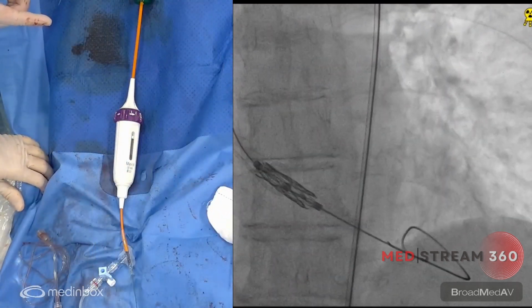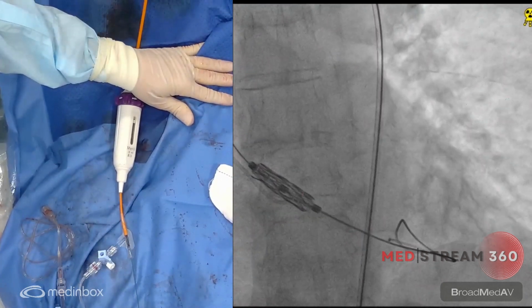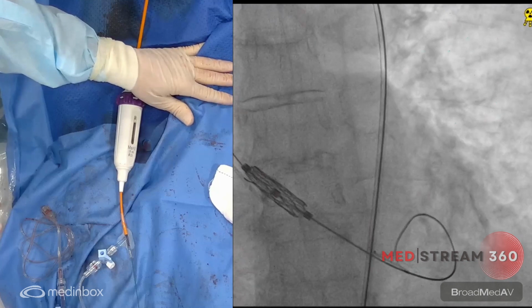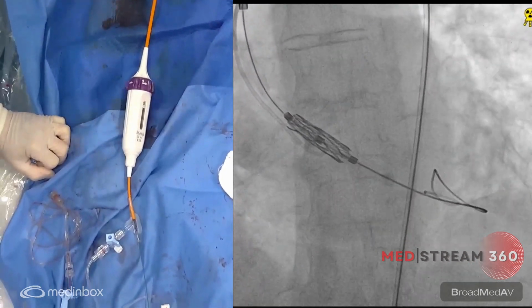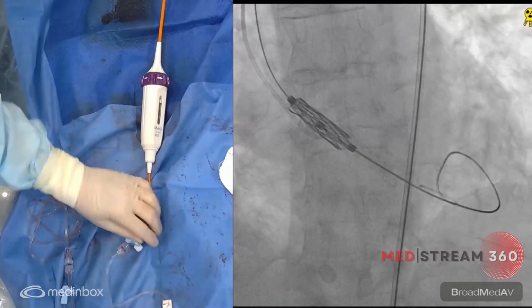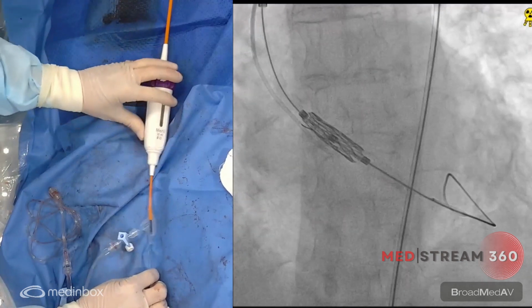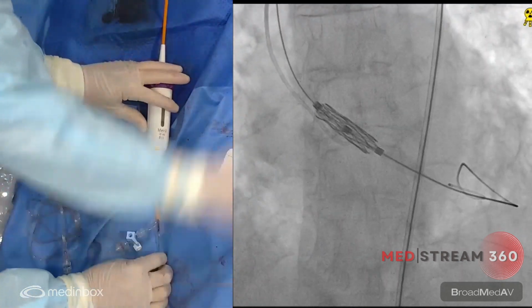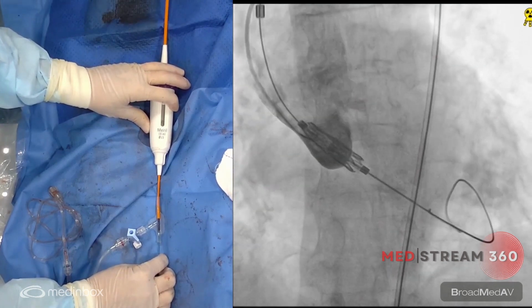Now the valve, I think it's in a good position, LAO 4. Okay. So as you told me before, we can see the second dense band. Then we position this band in the base of the pigtail. Usually this position is okay. So in bicuspid and tricuspid is it the same position, Dimitri? We tend to implant the valve a little bit higher when you are treating bicuspid.